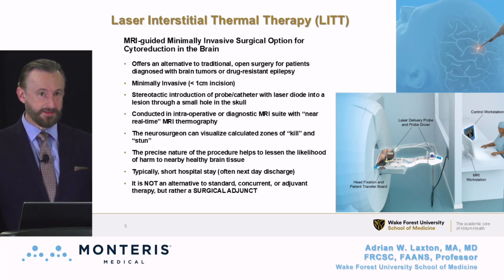It involves stereotactic techniques, but it's able to be used with whatever stereotactic techniques you use. So you don't commit. There isn't a NeuroBlate-specific stereotaxy. Whatever you're using, whether that's CRW, Leksell frames, ROSA robots, Renishaw robots, Globus, Starfix, it's completely agnostic to the stereotactic technique, but it is a precise, accurate stereotactic type of procedure.